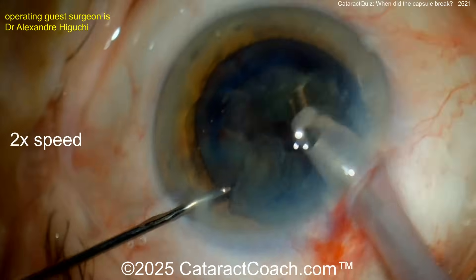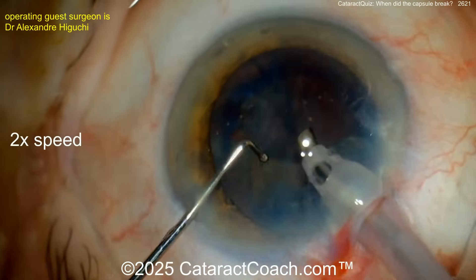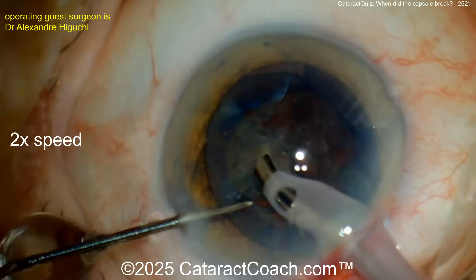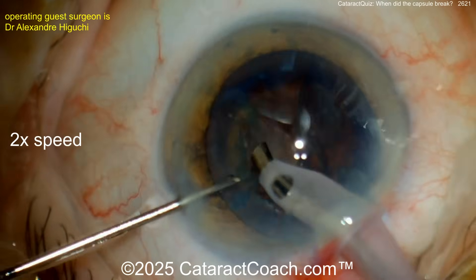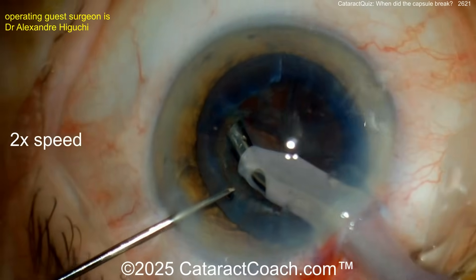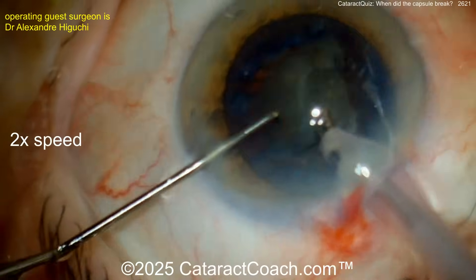No issues — looks pretty good. Now switching over to maybe a smaller tip. Still a ball tip on the end, so it's a blunt chopper, not a sharp one. At this point everything looks okay — the bag is intact, no issues at all.